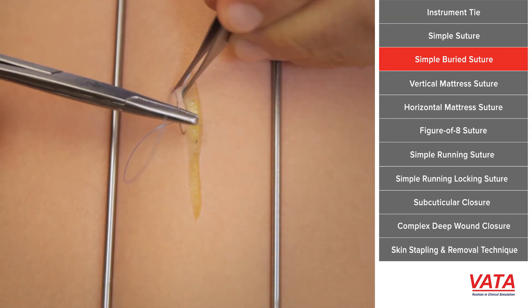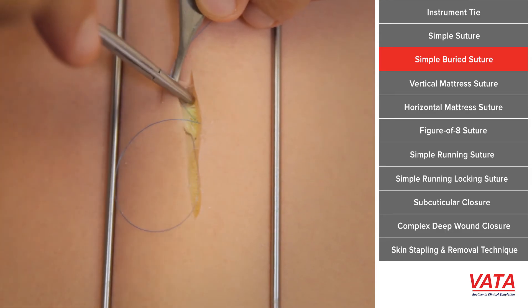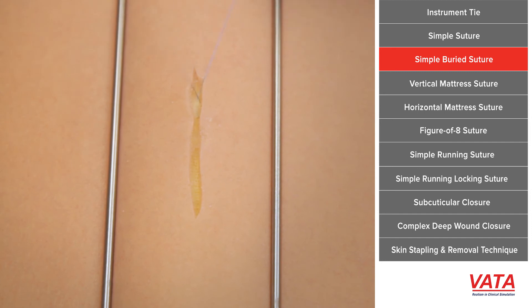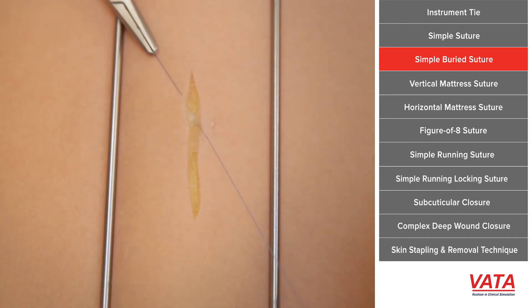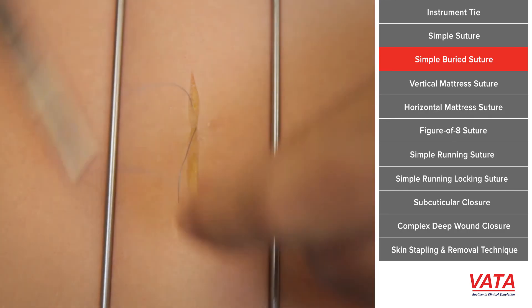So you need to get deep, grab some of that deep dermis — which in this case is that little piece of mesh — and make sure you're entering the same place where you exited on the other side. Just as superficial as you are on one side, you must be superficial on the other side, or else your skin edges will be uneven.